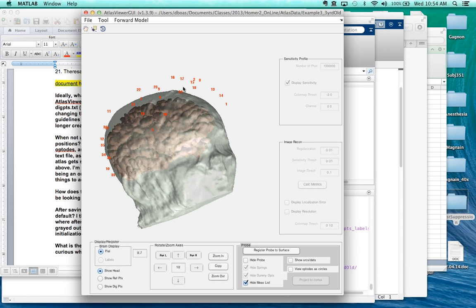And this is still an early version. So we've been making a lot of updates, and it's getting more and more stable. So some of it may just require starting in a fresh directory to make sure there's no historical stuff messing up the results. Okay, that's a good tip. Thank you.